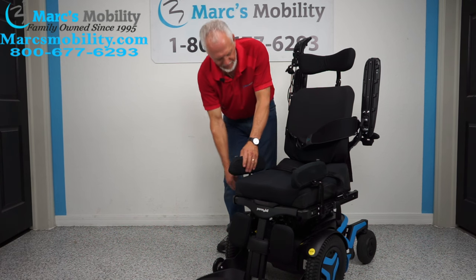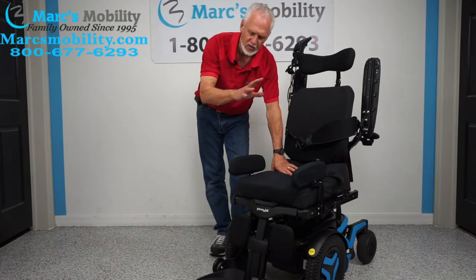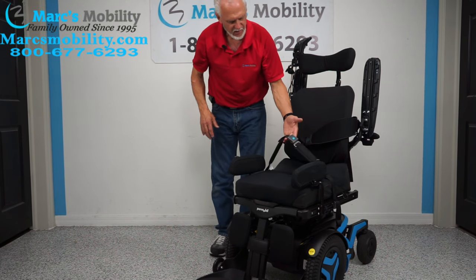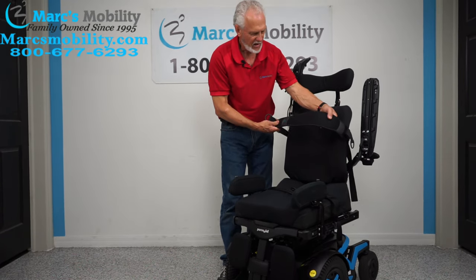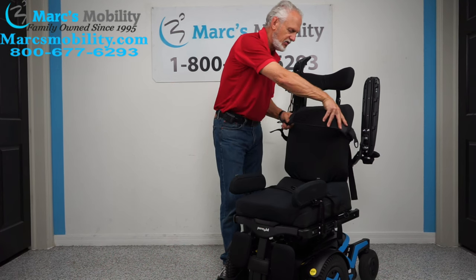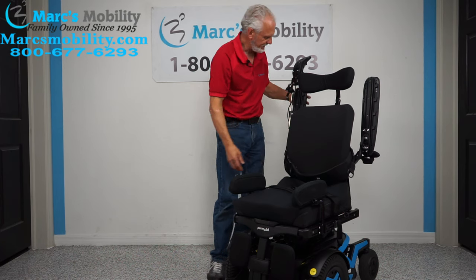The cushion on here is 18 by 20, but whatever size you need we can get that for you. You have a safety belt. This one also has a chest guard — so if you have a person who needs to be kept in, this can be adjusted so your chest doesn't move forward, or we can remove it if you don't need it.